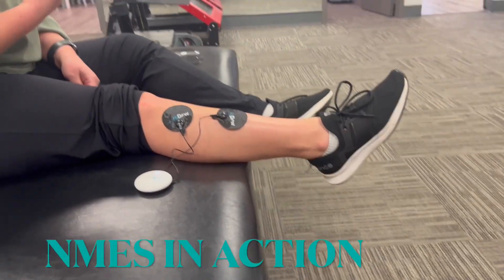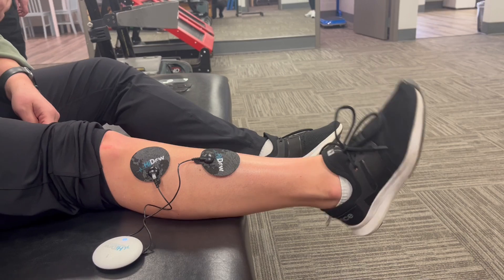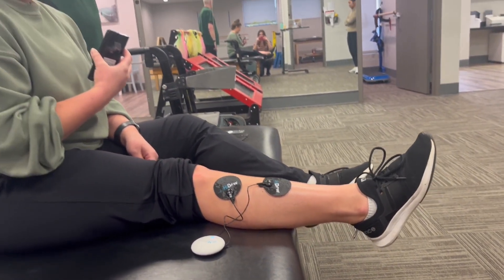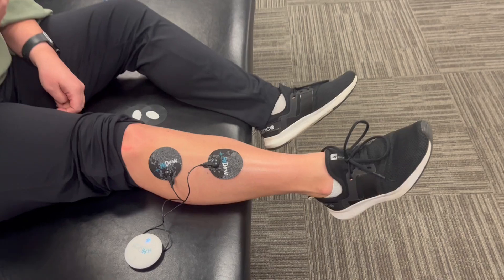Here's an example of our HiDew NMES unit at work. You can see it's portable with electrodes that go directly onto the muscle we're trying to stimulate. Her toes are being brought back up involuntarily.